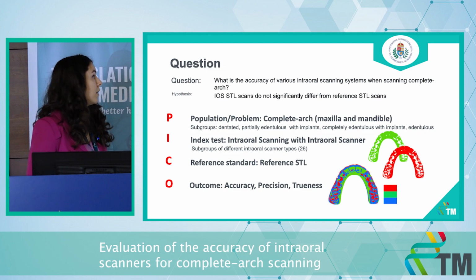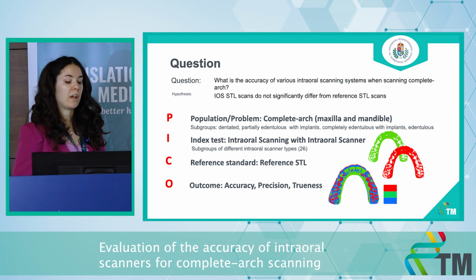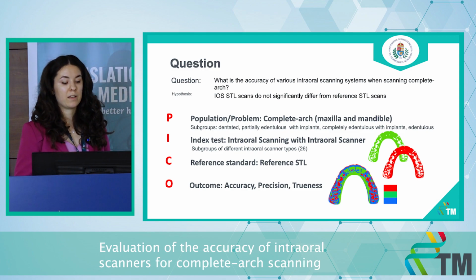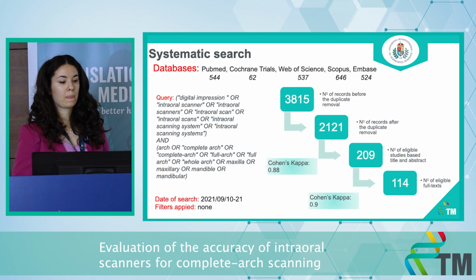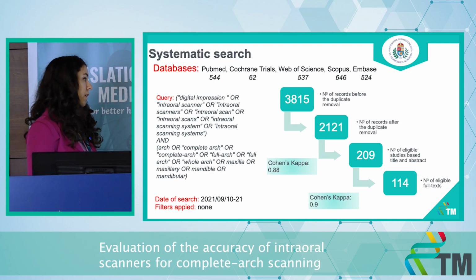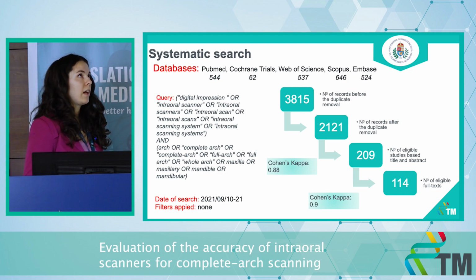reference STL files. In our PICO framework, we investigated complete arches and 26 different IOS systems, and as comparators, we had reference STL files generated from laboratory or industrial scanners. In the outcome part, we measure the accuracy, which consists of precision and trueness values. In the systematic search, we made a search in 5 databases, and in the end, we got 114 eligible articles from which we can do analysis in 53 articles.